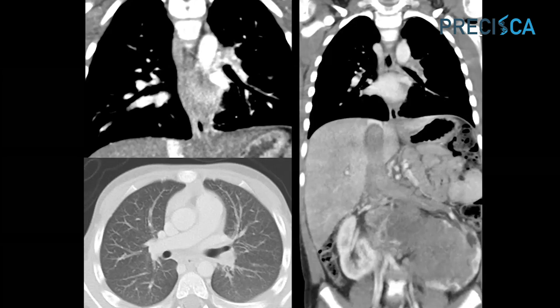Now, the classic characters that are known for metastasizing to the chest via embolic disease to the pulmonary arteries in the adult include hepatocellular carcinoma, adrenal cortical carcinoma, and renal cell carcinoma. Occasionally, we'll see uterine neoplasms metastasize in this fashion as well, but those are much less common. In children, a Wilms tumor is much more likely to do this as compared to a neuroblastoma. So when we see that, we can make that comparison as well. So it's very useful to look for this enhancement to make that distinction.